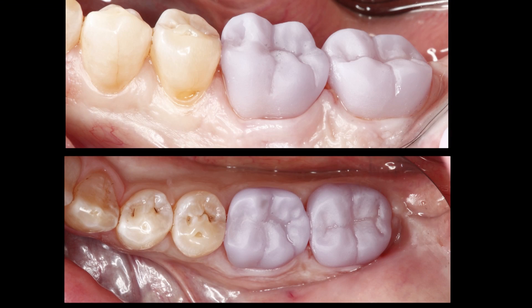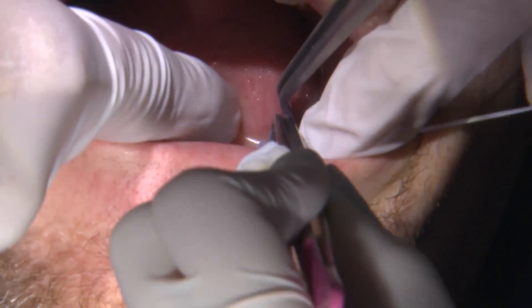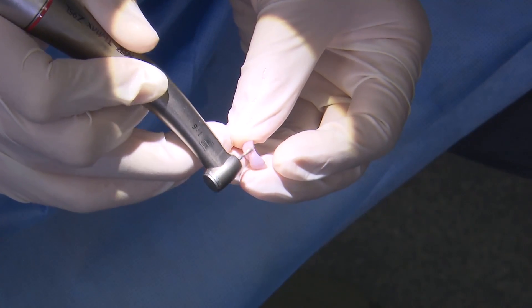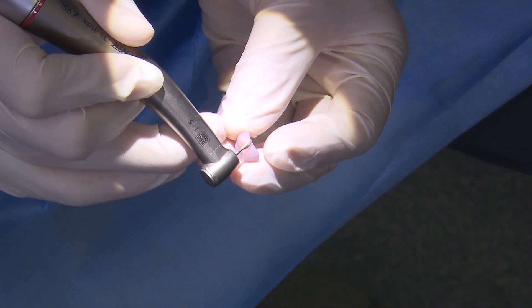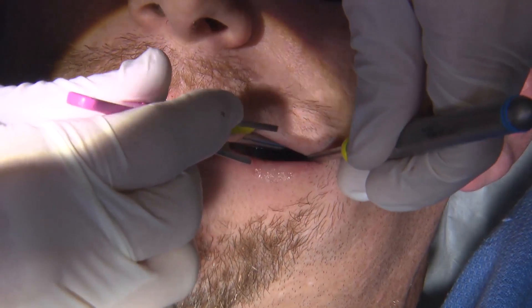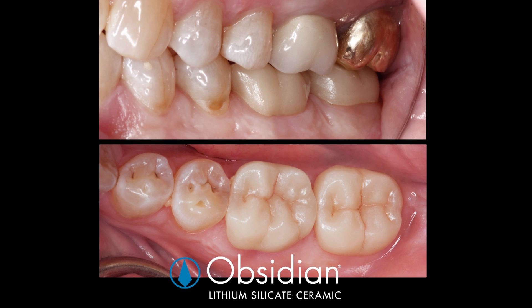I do try in the restorations prior to putting them in the porcelain furnace for the crystallization cycle, because at this stage I want to adjust the contacts and verify that the occlusion is where I want it. Any adjustments are much easier to make in this pre-crystallized state. I also take advantage of the required porcelain oven cycle to add a few stains to the occlusal and axial surfaces.